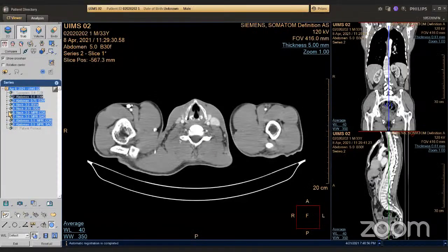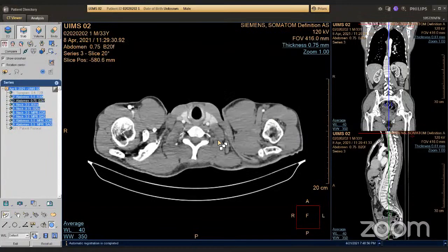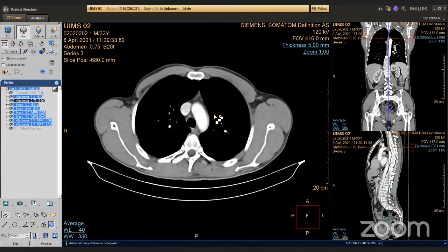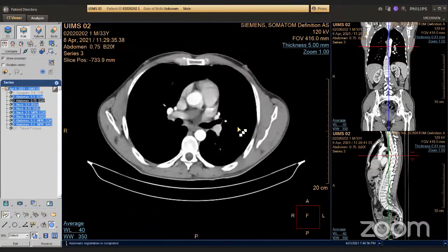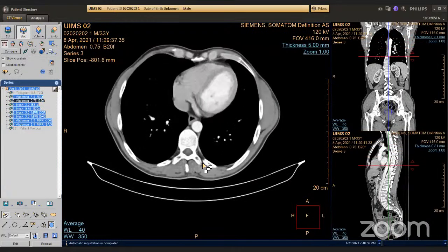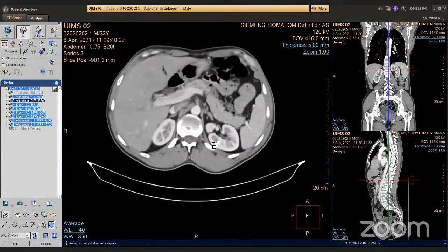So we have another investigation here, and this is actually with contrast agent. I will again do 5 millimeters, and I will show you how we are now describing the X-ray, the CT. Let's start. I will show you some more things we can do with the contrast here.